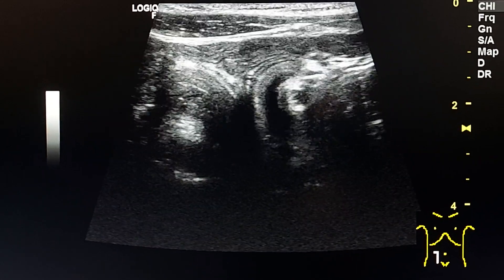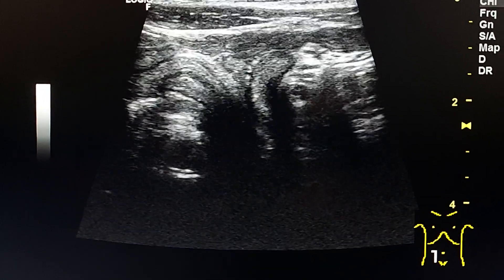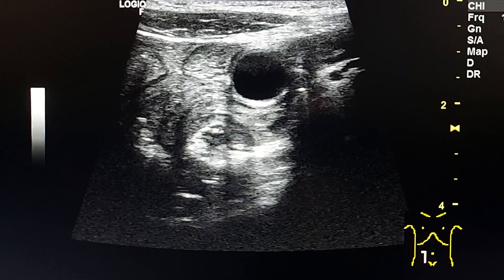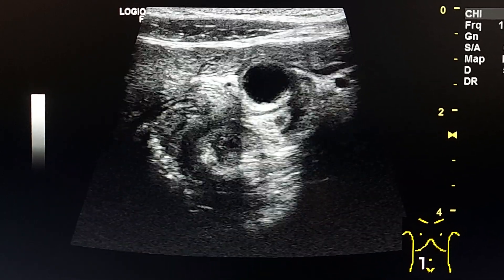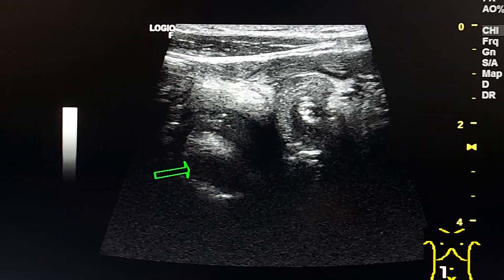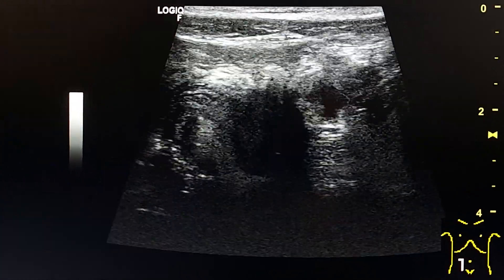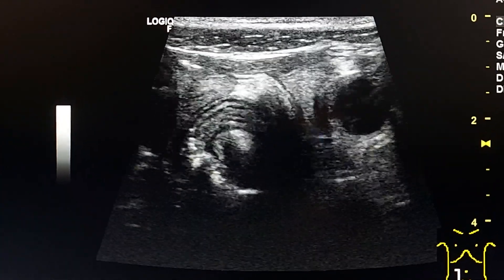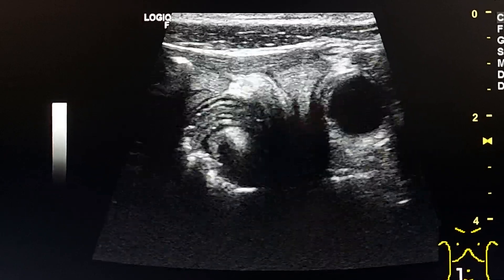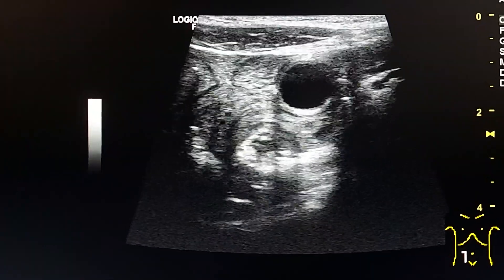Here we see two whirlpool signs — this is one and this is the other. This confirms small bowel volvulus because of the diverticulum.